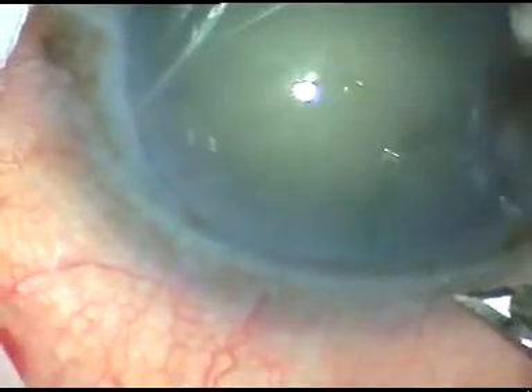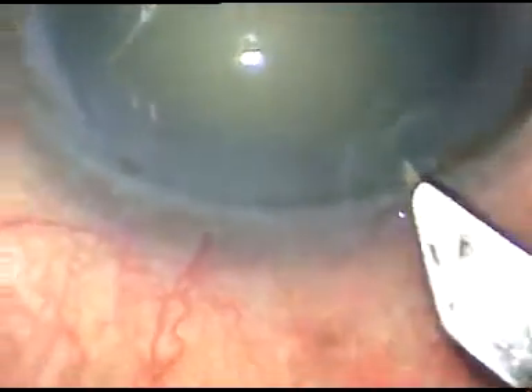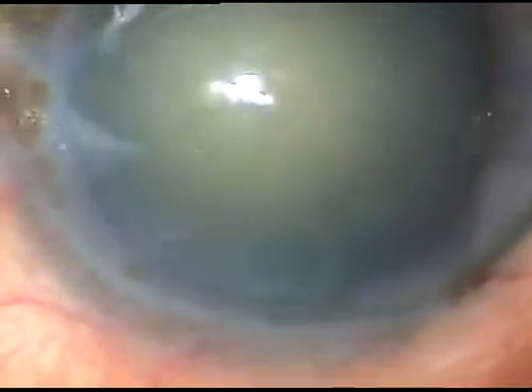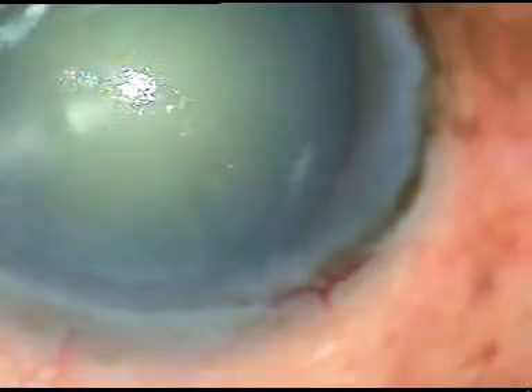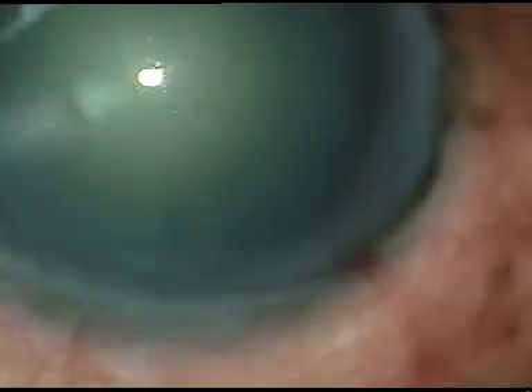Dear colleagues, this is a one-eyed patient. I have taken up this case for surgery under topical anesthesia, because I don't want to subject the patient to the risks of peribulbar anesthesia.